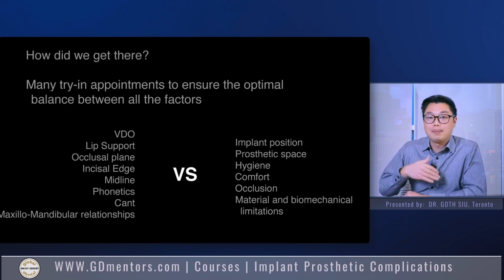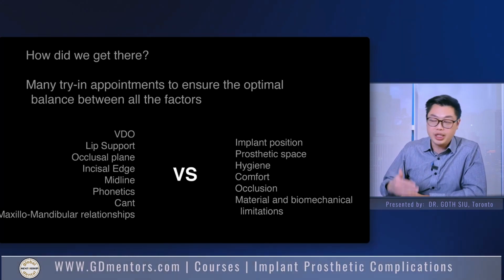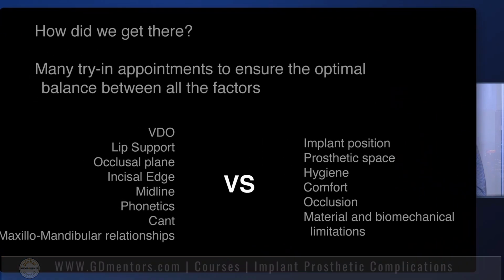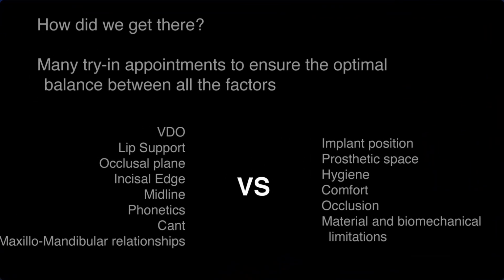And then there's also the subjective component to this, which is the patient. Like, is it comfortable? Some patients say, oh, this is too bulky. Even though you get ideal lip support, they feel so bulky. They can't clean it because the more lip support, there are potentially more ledges, and then people can't clean it, right? And then you got to balance it with the occlusion and make it work. And then based on all that, you got to choose the proper materials so that it holds out and doesn't break.